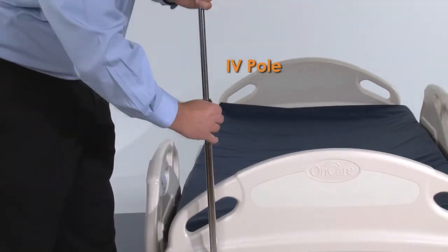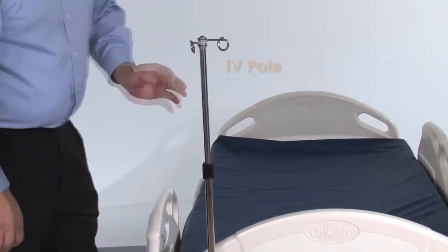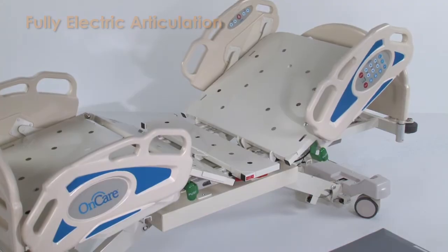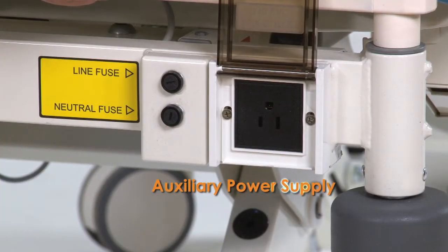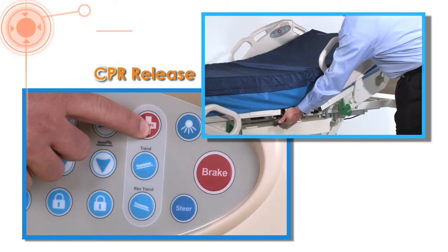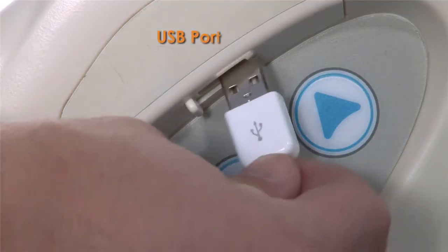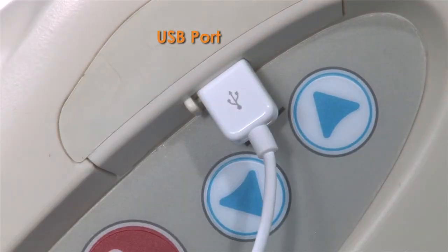Other standard features include an integrated IV pole, fully electric articulation including auto contour, auxiliary power supply, manual and electronic CPR release, integrated pump holder, and a USB port for patients' personal electronics.